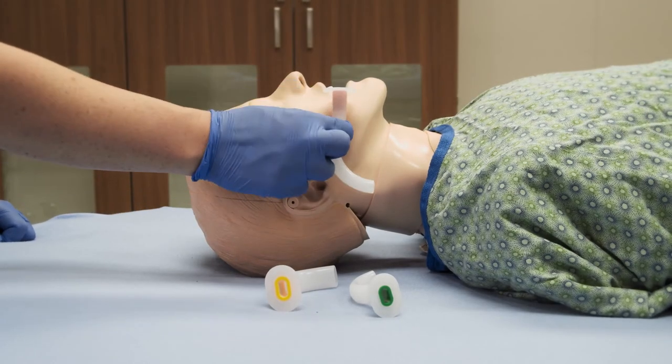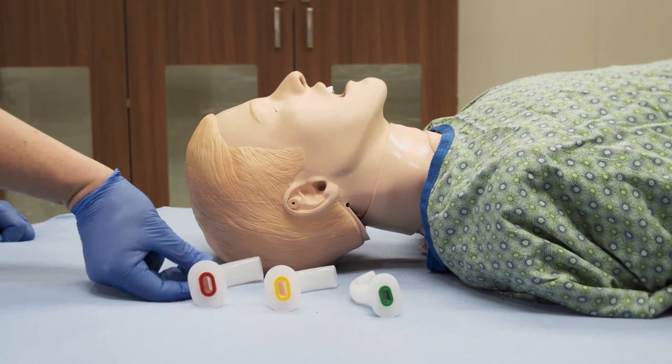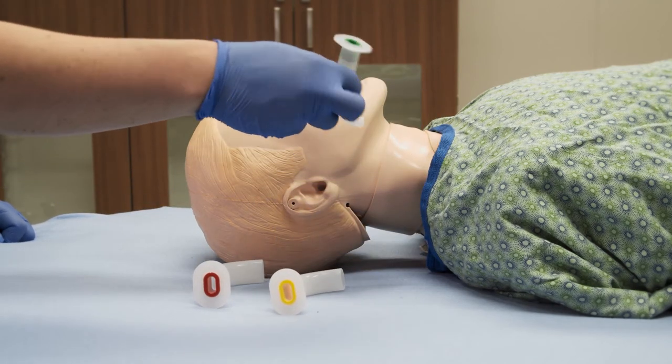Measure the appropriate size of the OPA by measuring from the tip of the earlobe to the corner of the mouth.